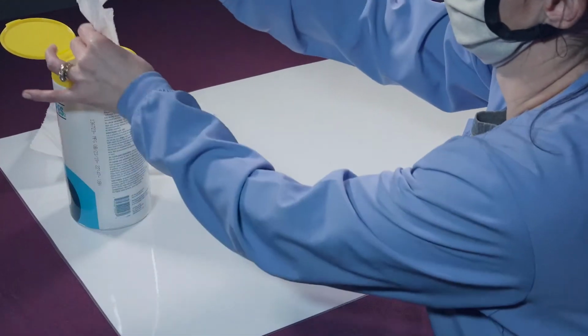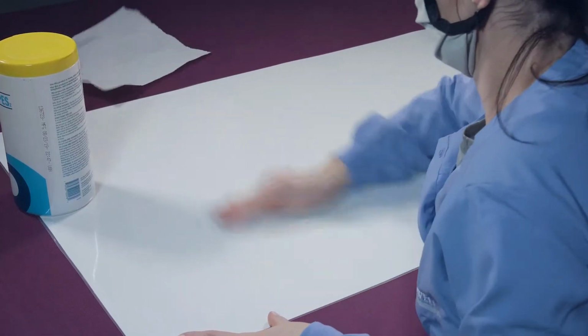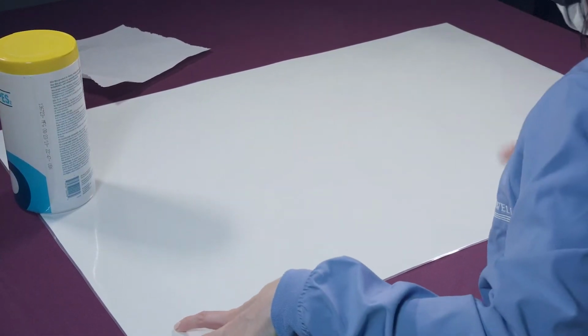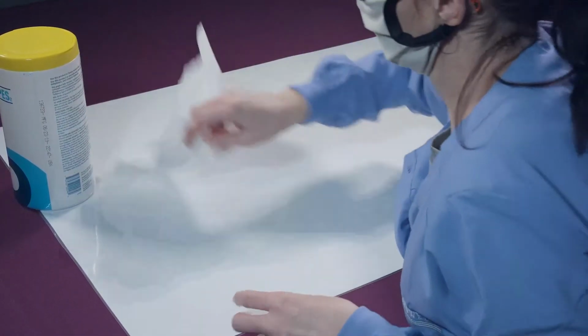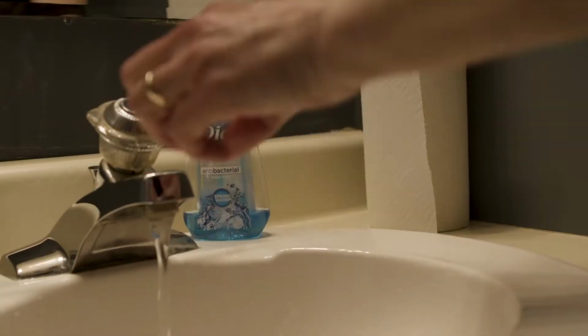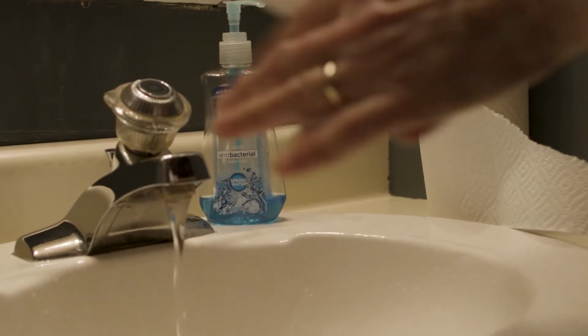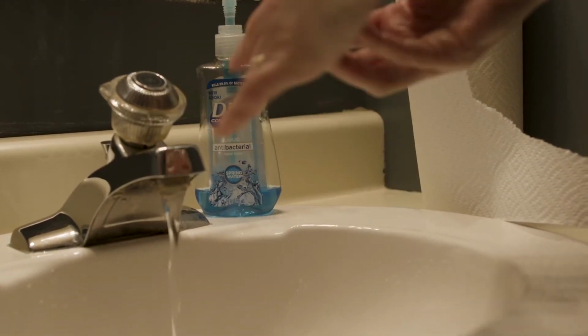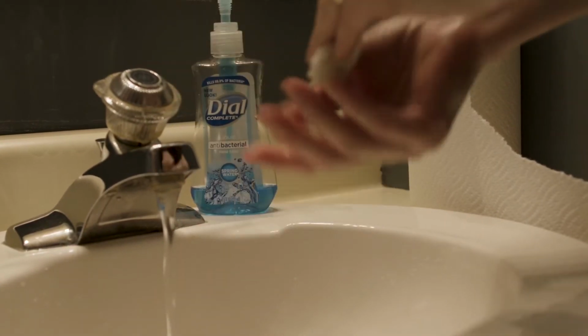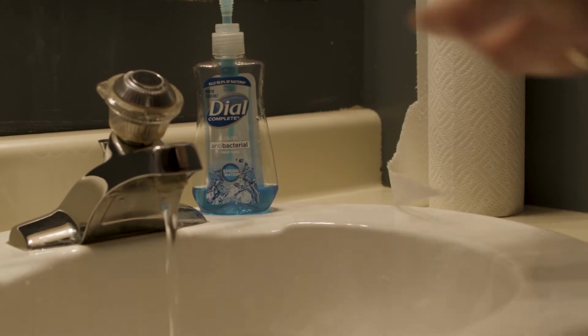Please begin by preparing your work surface by cleaning the area thoroughly with soap and water or a disinfectant wipe, and drying thoroughly as well. Wash your hands thoroughly for at least 20 seconds and dry as well. Use a separate towel to turn the faucet off.